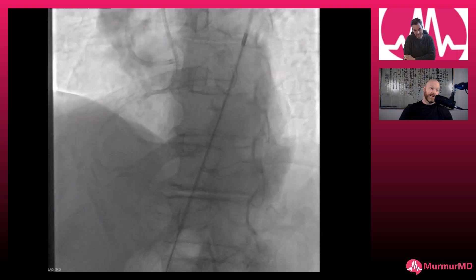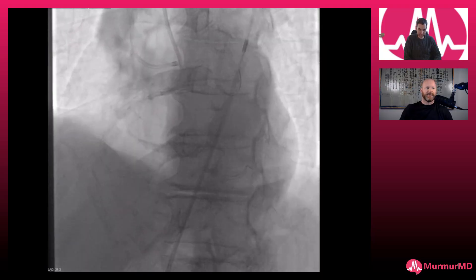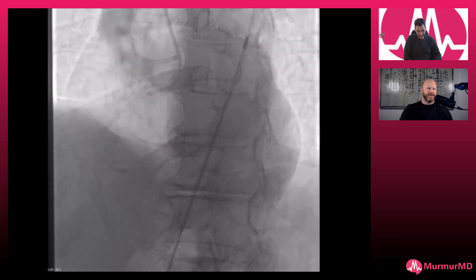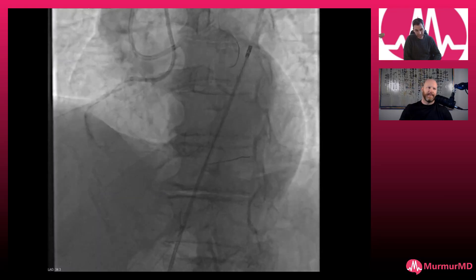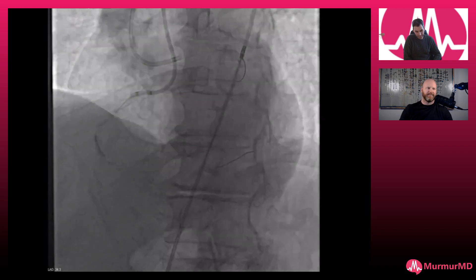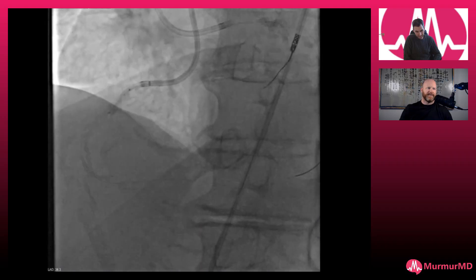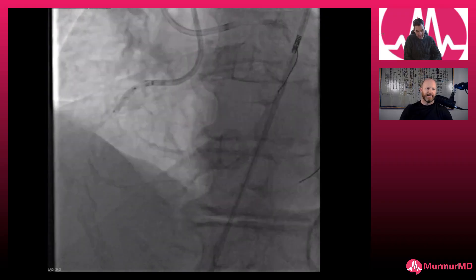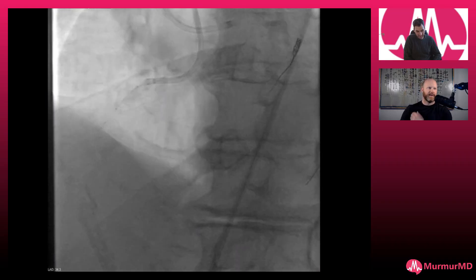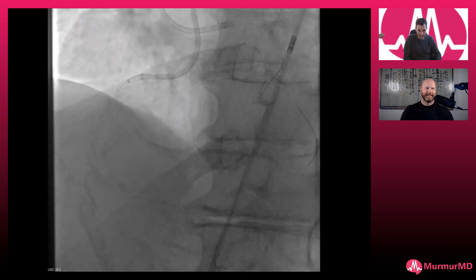We were able to deliver lithotripsy actually with just the use of a guide extension — we didn't really do anything special. The balloon expands pretty nicely here even after just starting to pulse. There's a little bit of waist but we get pretty good expansion. There are a lot more calcs where I got stuck, so this is going to be the not-pleasant part — and it gets bigger and bigger as you can imagine. We had a bubble in here; we should have reprepped this balloon. We reprepped the balloon and re-seated it because the bubble wasn't doing anything for me. The expansion looks good though, even in the gnarly mid part where the bends are and where the microcatheter was getting stuck.